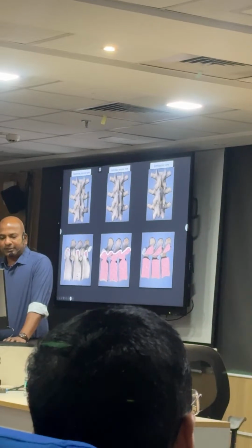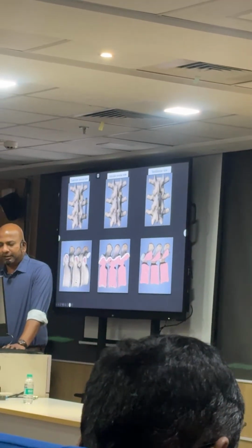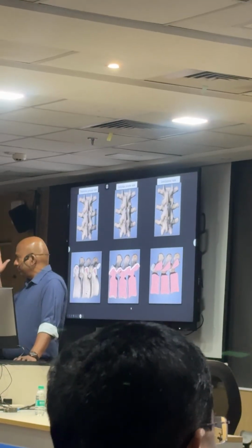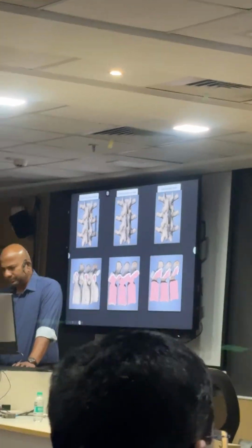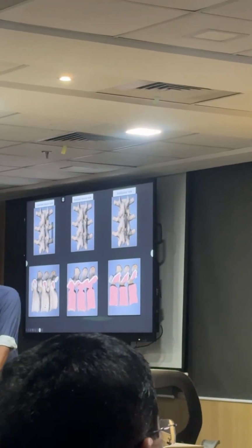Okay. So in the transverse process view, there is an intermittent hyperechoic line, whereas once you arrive at the articular process, this intermittent hyperechoic line will become a continuous line. And from there, if you make an oblique tilt across the interlaminar space, this continuous line is again broken, and then you have an intermittent hyperechoic line, but the shape has completely changed.